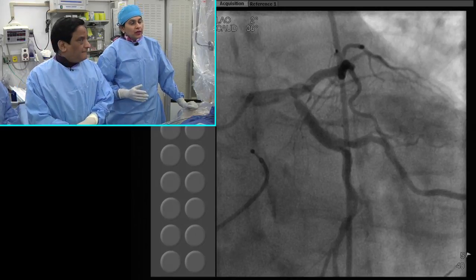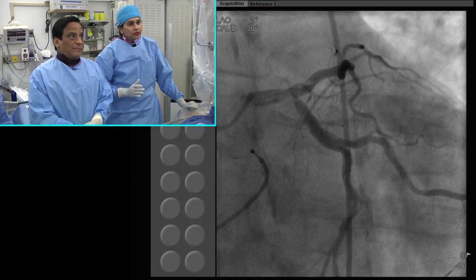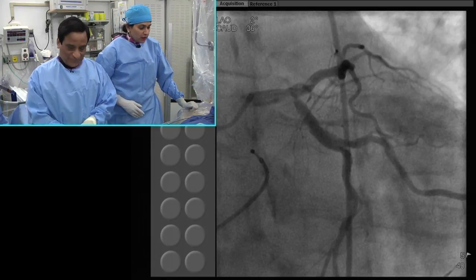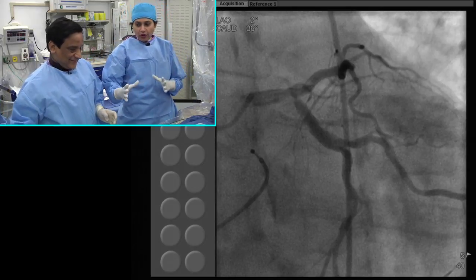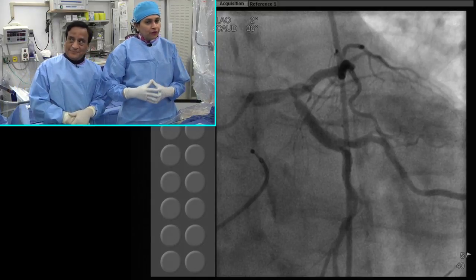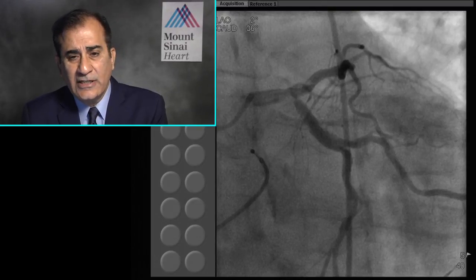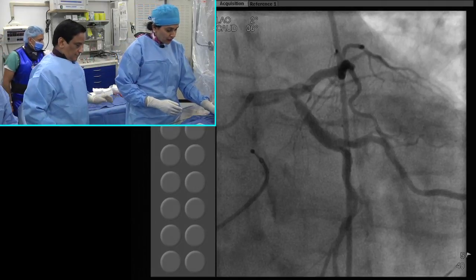I mean, I can just give you my point that this case itself is so complex. We are thinking of using a balloon pump or Impella. I would say you're crazy to think that you want to do radial. Excellent. Okay, the goal here is, you have a tough complex case. We are going to decide how we are going to do the case. You just do those steps 1, 2, 3, 4 and come out without any complication. That should be the goal. The reason I mentioned transradial here was exactly to steer away from that. This is not the case that you want to even think of it.